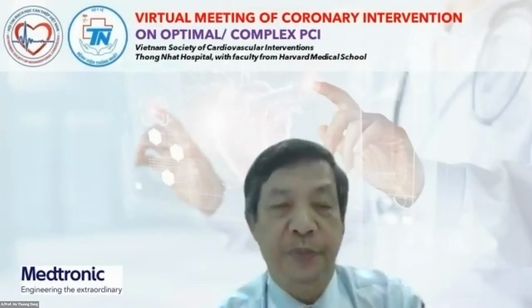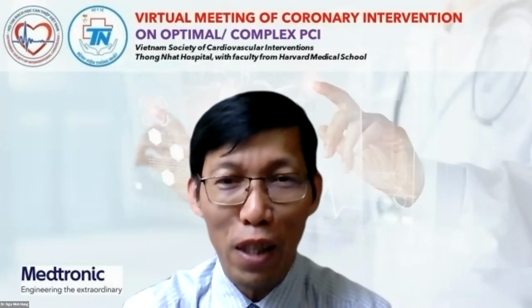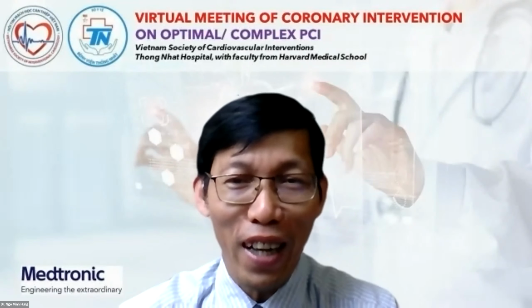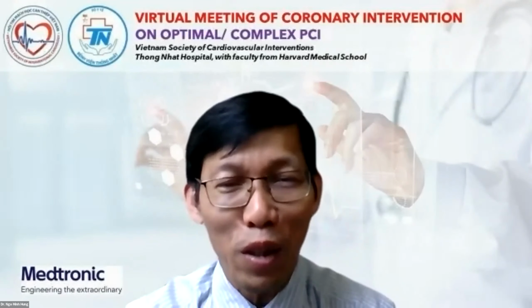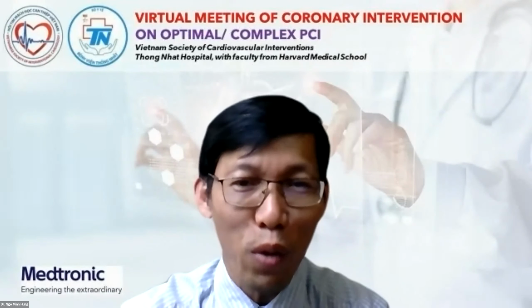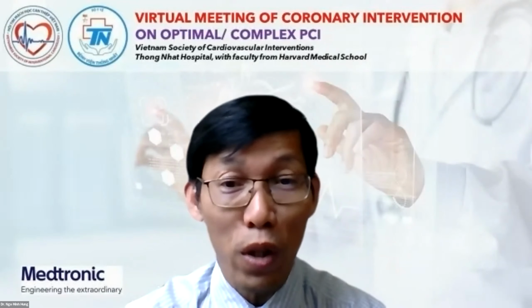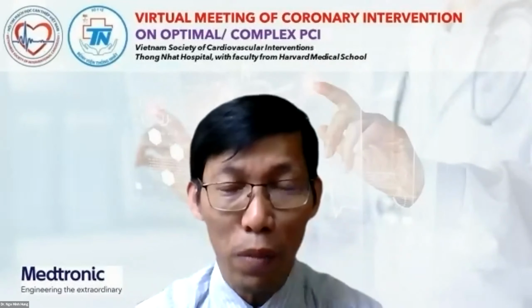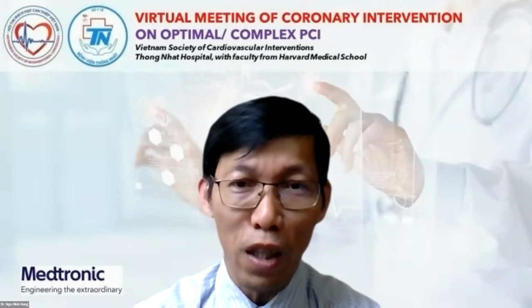Thank you very much, Dr. Duong, Dr. Pinto and Dr. Quang, for the very good comments on the CTO, because you have already dealt with CTO before, and Professor Quang is also a CTO guy. So I also pay attention to when to stop. If the procedure is too long and the patient cannot tolerate it, we also try to stop, but I choose the safety of the patient. We stop, but the patient has to be in a good situation. That's important, because the next time we have to continue our work in order to finish the CTO.